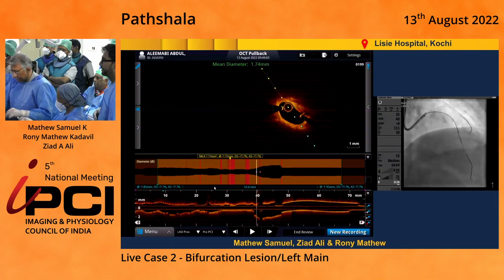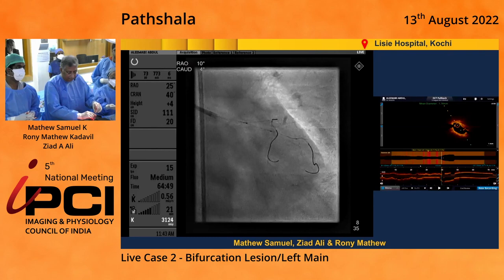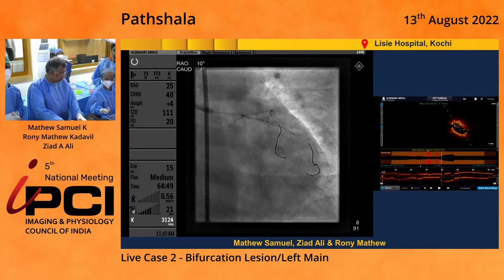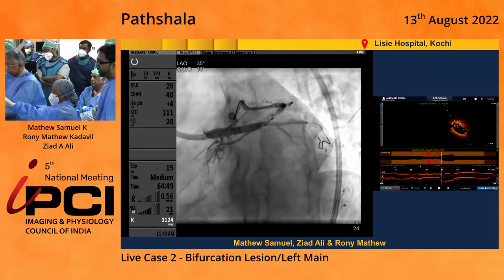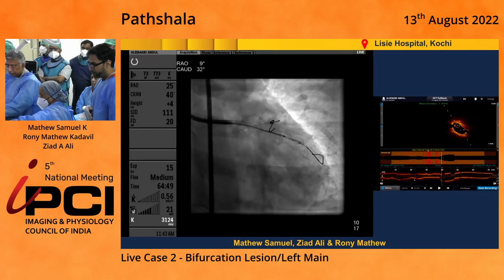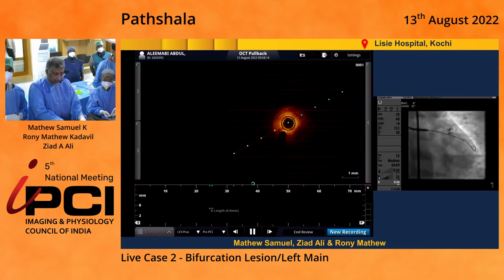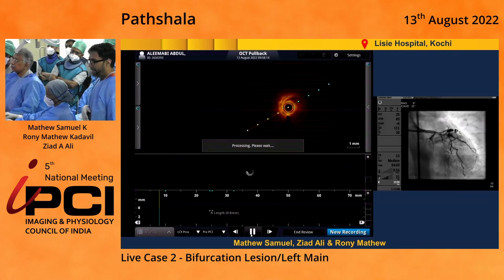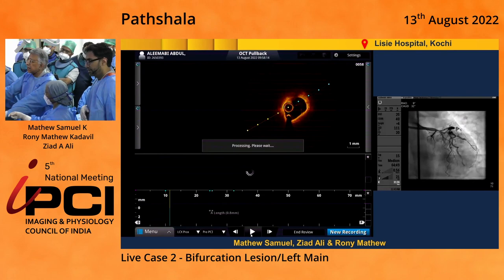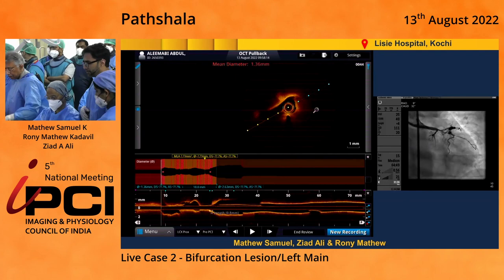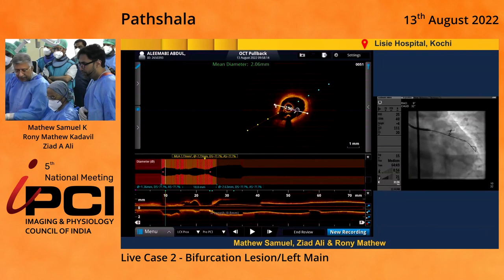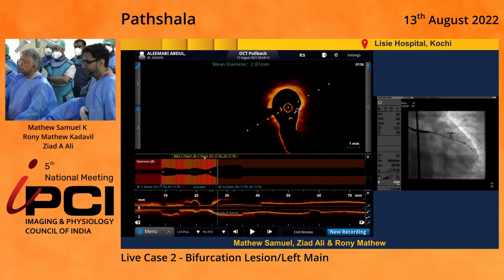Go back to the angiogram, please. So what we did is we then dilated the circumflex. And then we actually decided to get a little bit of a better run. We went ahead and dilated after we placed our circumflex stent. So the circumflex OCT - I want to run through this relatively quickly because there's some action in the case. Here you can see our distal vessel. We're going to use the MLD max approach. Our distal vessel actually measured at 2.89. So this was distal 2.9. And proximally, here's the LAD. We came 3 millimeters back and we chose an 18 stent.